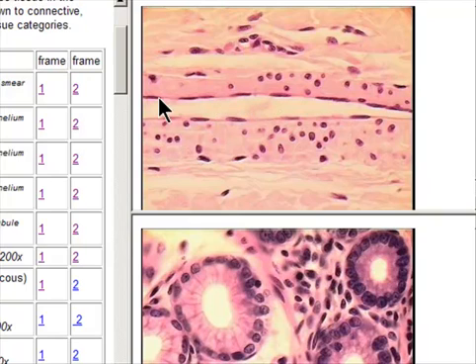So you can see that these are flattened, and in case of epithelium, you invariably always find an open space, which if it's the inside of the cavity, then we call it the lumen. So this is the lumen up here. Here also, look at this, an open space, so that's the lumen. Or if it is skin, for example, on the outside, again, you will see open space. So, one surface of the cell is always free, like, for example, over here. So you can see this is a simple squamous.